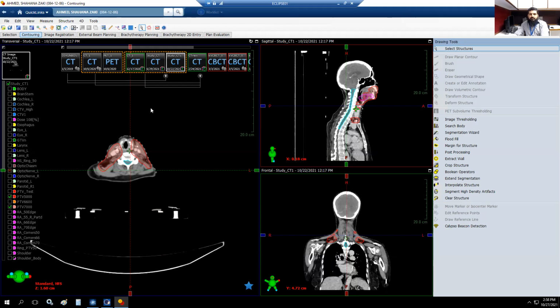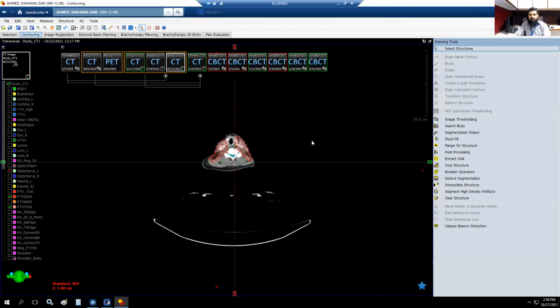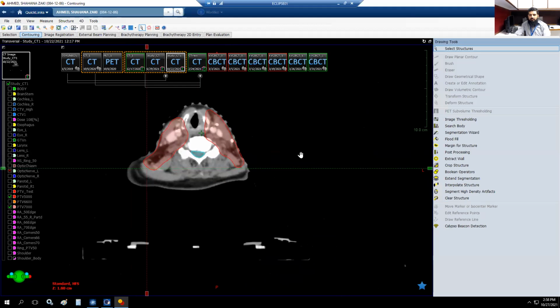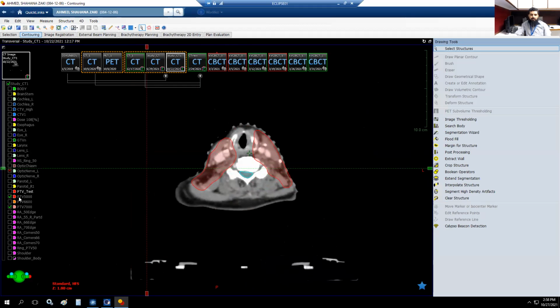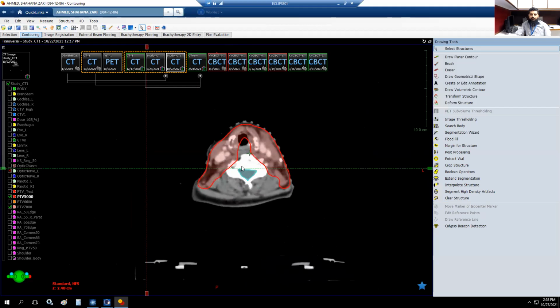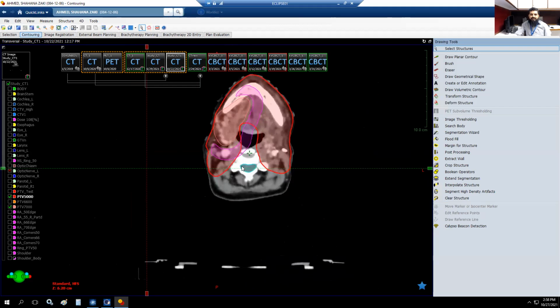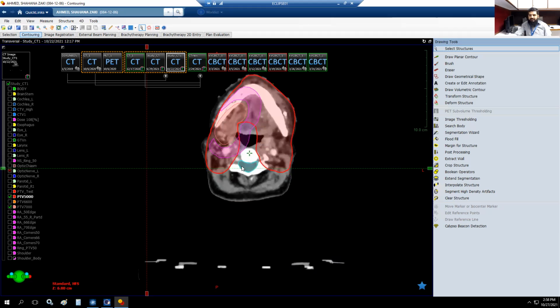Excuse us, because if you can see the patient name or MR, just consider this is the patient. This is our PTV 5000 defined, which is for phase 1. The prescribed dose is 200 cGy in 25 fractions.